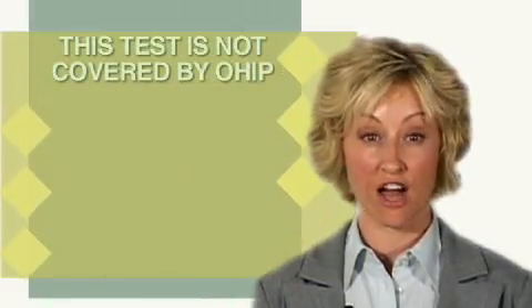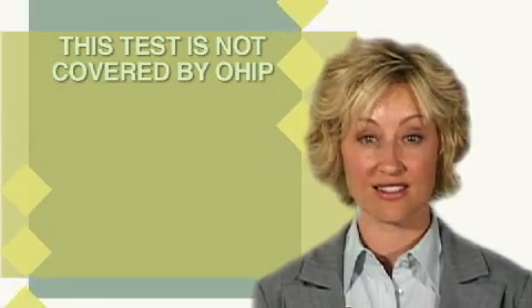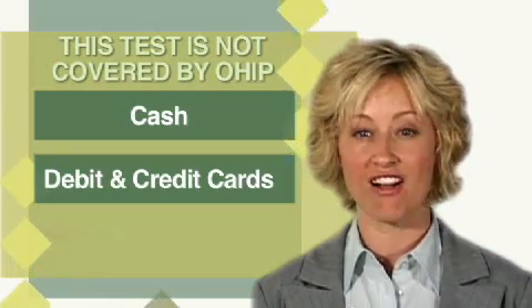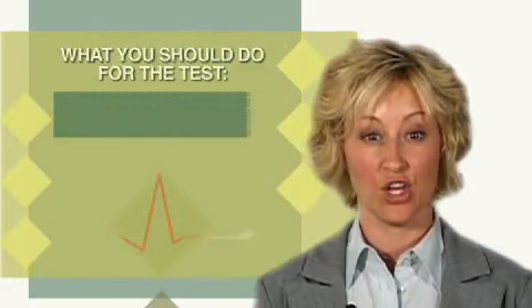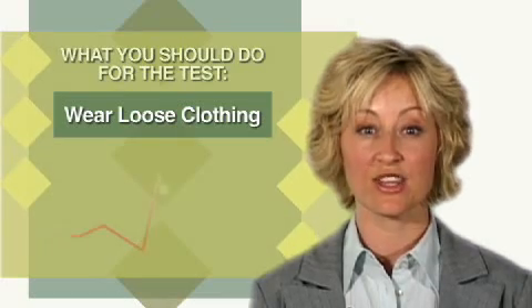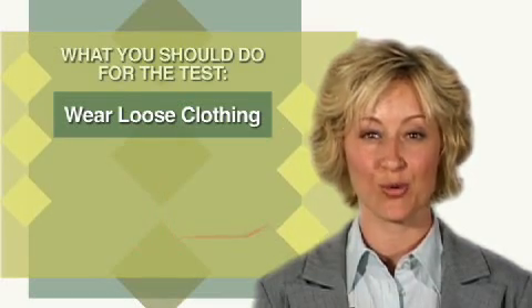This test is not covered by OHIP, so it is necessary to be prepared to pay for this test. Cash, debit, and credit cards are all accepted methods of payment. You should wear loose clothing and a short sleeve shirt if possible, so that the blood pressure cuff and monitor can be worn easily.